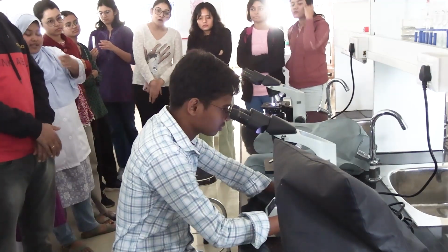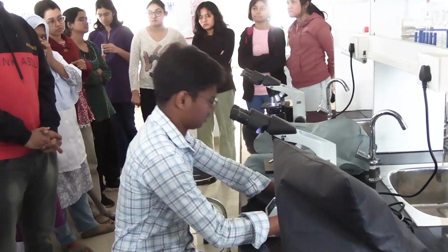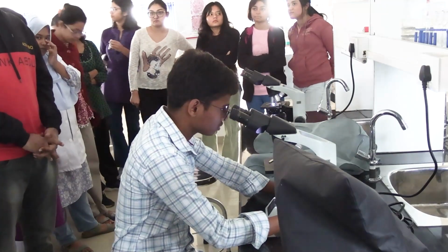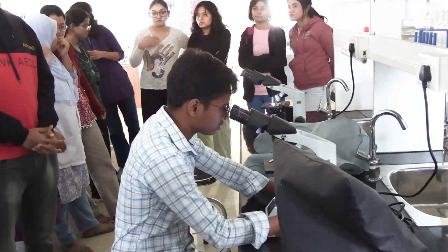অন অ্যান অ্যাভারেজ দেখি, ঠিক আছে? মানে কিরকম দেখা যাচ্ছে, আর উই রিলাই অন দ্য এমসিভি এমসিএইচ এর ভ্যালুস, ওকে? আর ওই সব কন্ডিশনে এমনি যেটা ডাব্লিউবিসিতে যে অ্যাবনর্মালিটি, ওটা মোস্ট ইম্পর্টেন্ট হয়ে যায় আমাদের জন্য, ঠিক আছে?